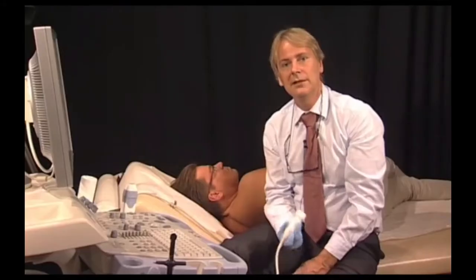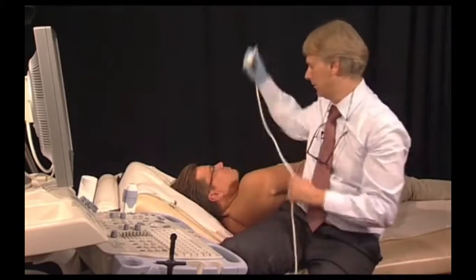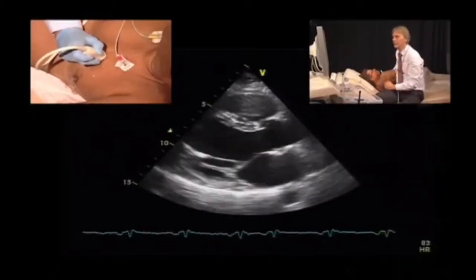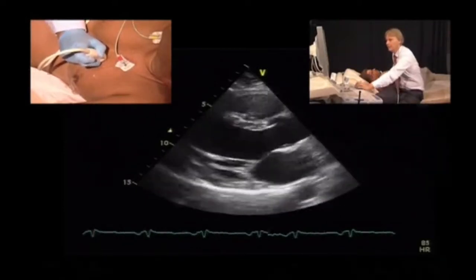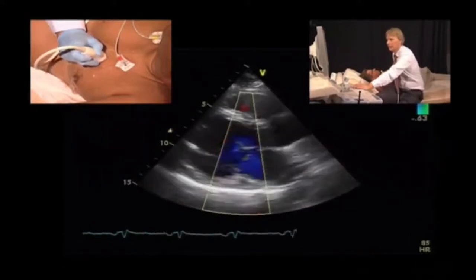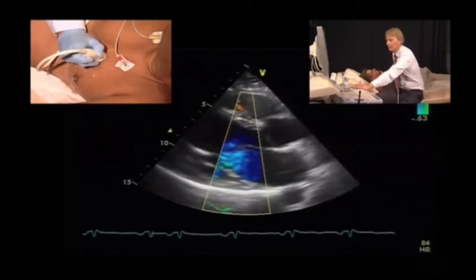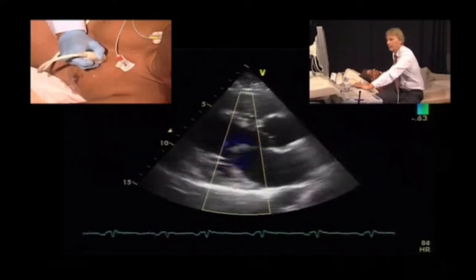Now we'll take a look at a patient with MR. Let's see if we can find out where the origin of the jet is together. We'll start with the parasternal long axis view, and we will look at the regurgitant jet, which we can see quite nicely here. It's probably mild to moderate regurgitation, certainly not more.